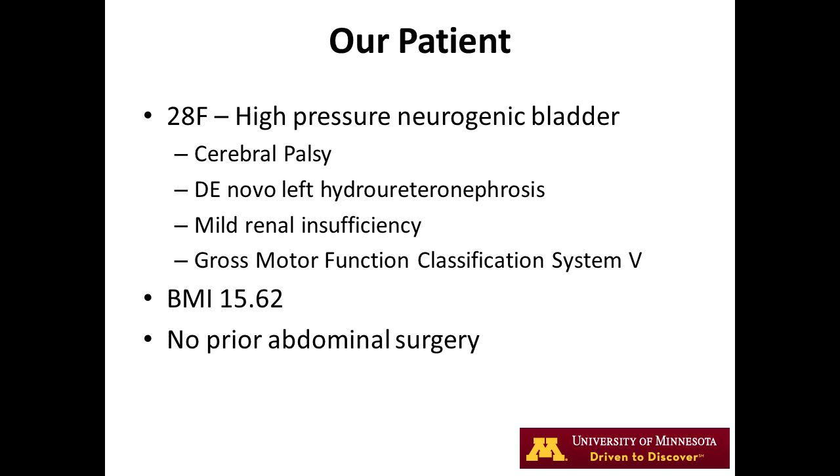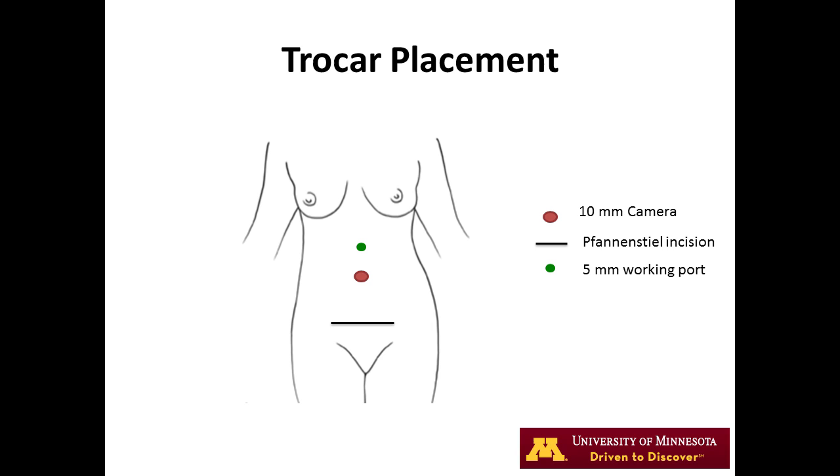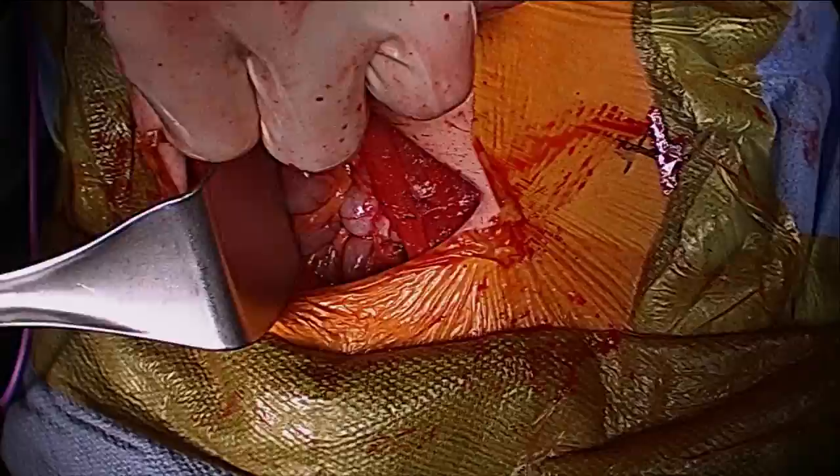A 10-12mm camera port is placed through the umbilicus, later to become the stoma location. An additional 5mm working port is placed one hand-breadth cephalad to the umbilicus. We begin with a 10cm Pfannenstiel incision, then begin with an open mobilization of the cecum along the line of Toldt.